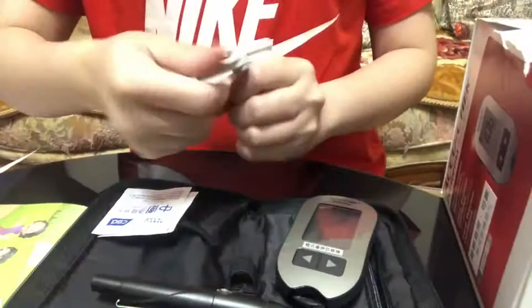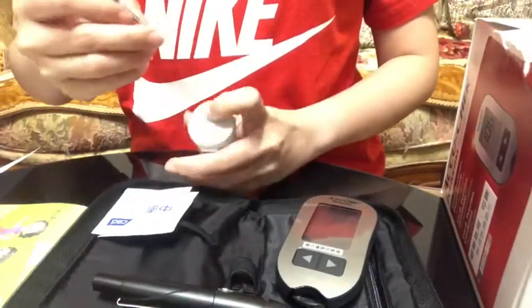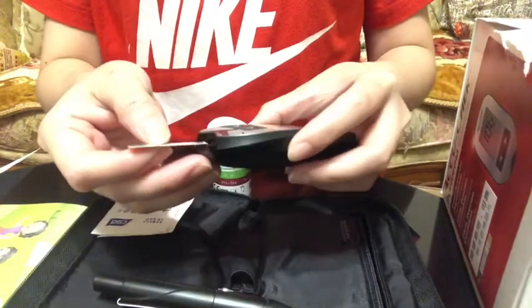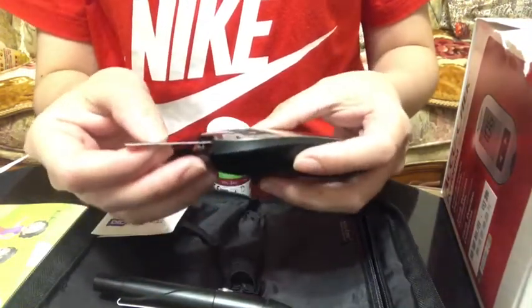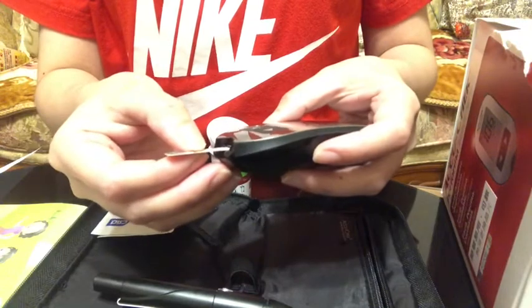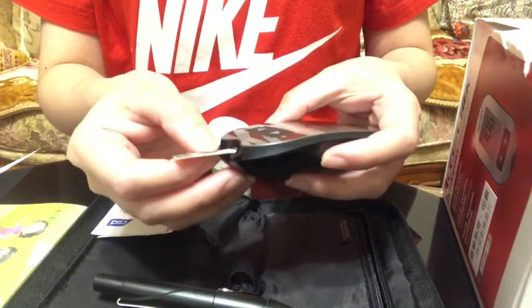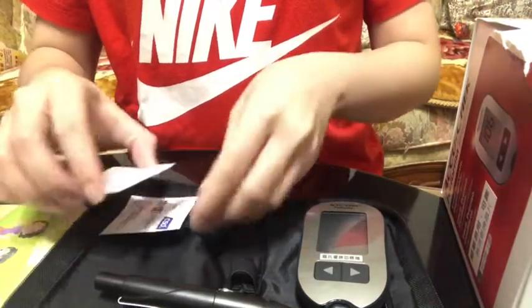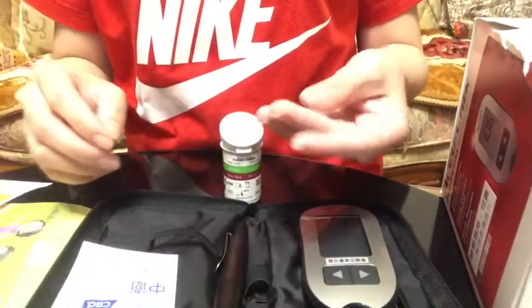Get a test strip and insert it into your glucose meter. Select your testing site.